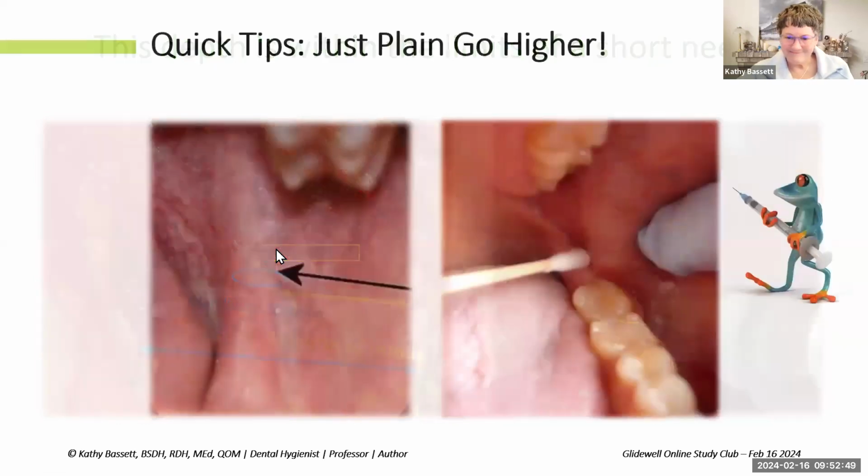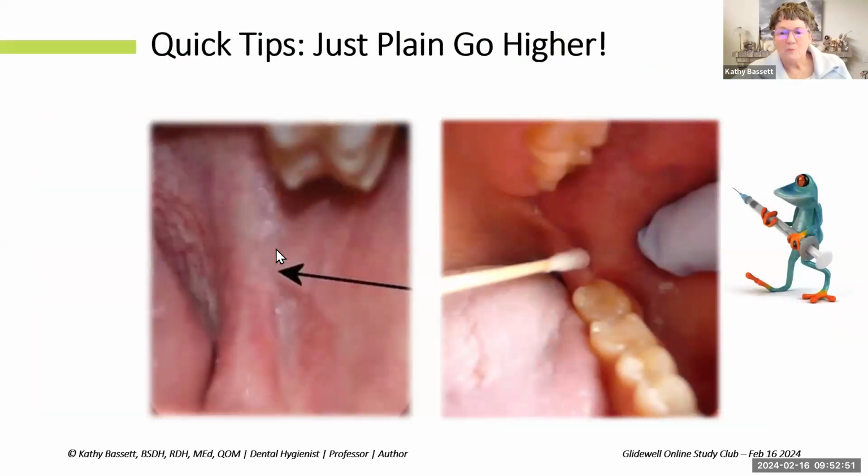Personal opinion. So when you pair this with a higher insertion point and short needles, they're going to provide reliable anesthesia. Each of these two animations is a little visual to help you think about more superior insertion points, which also, by the way, are less likely to have bony obstructions or premature contact on the way in.